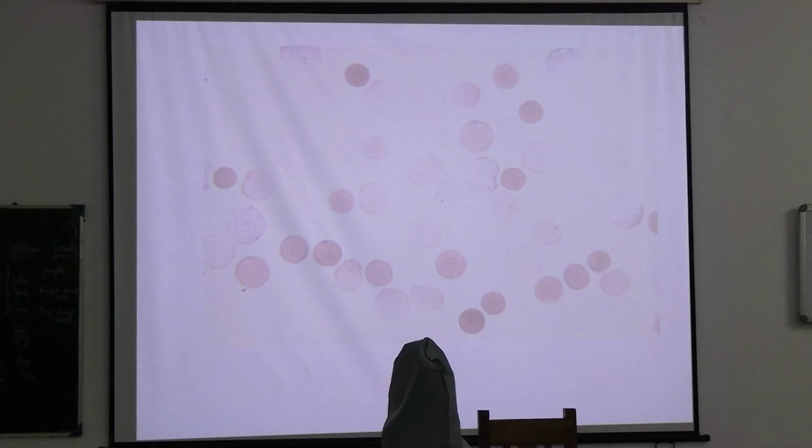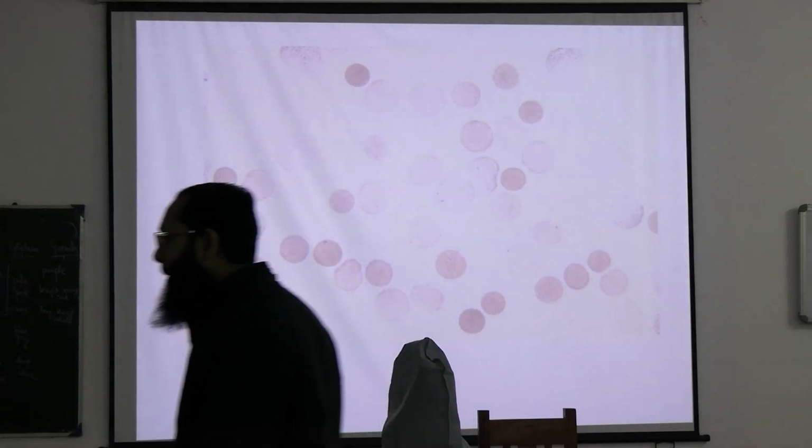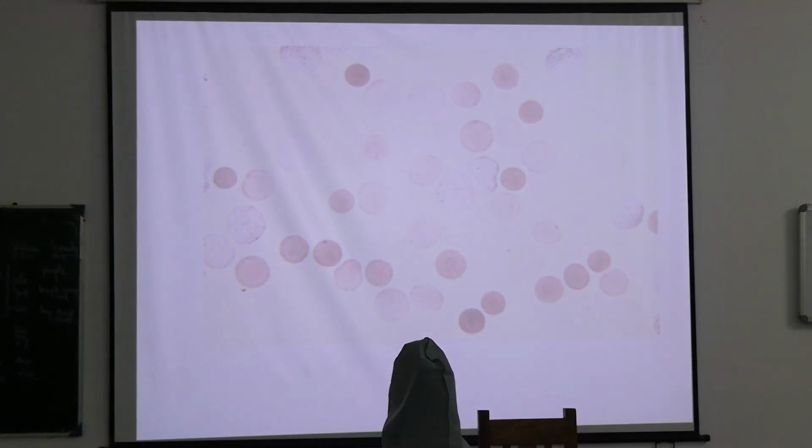And hypochromic or hyperchromic? Hypo. How can you say that? Pallor, where is the pallor? It seems to be hyperchromic. Where is the central pallor? Where has that gone? Size of the RBCs has decreased. But what about the central pallor?